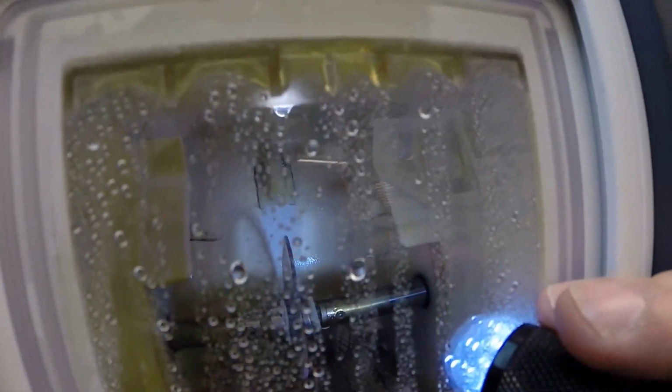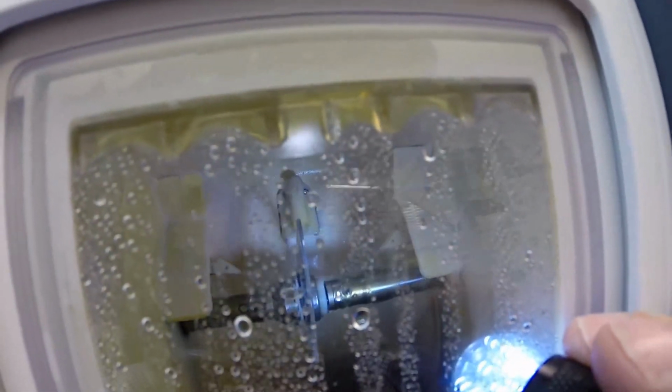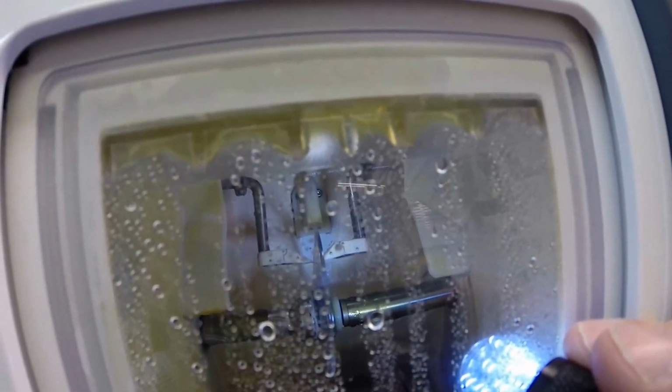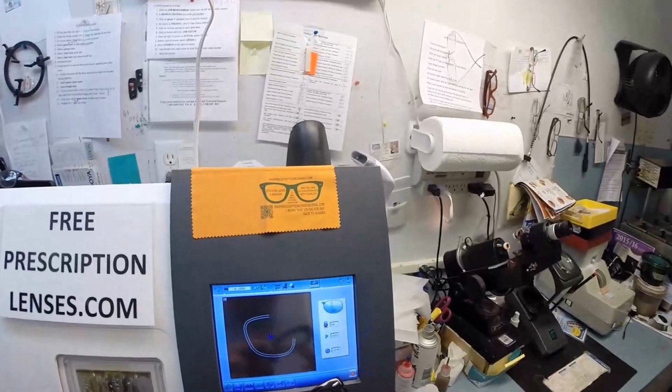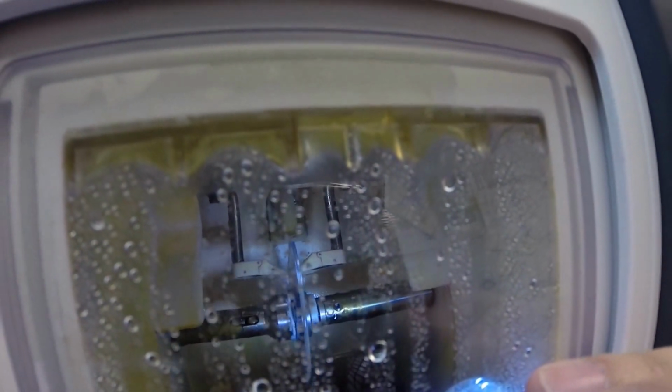Just like before, the door closes, the clamp shuts, and then the lens is going to be traced by the two white styluses again, making sure that it's large enough to fit into the frame. But you can see as it's going around tracing the shape of the lens. And as always, measuring the thickness of the lens to know exactly where to place the bevel so you have the least amount of edge thickness showing.